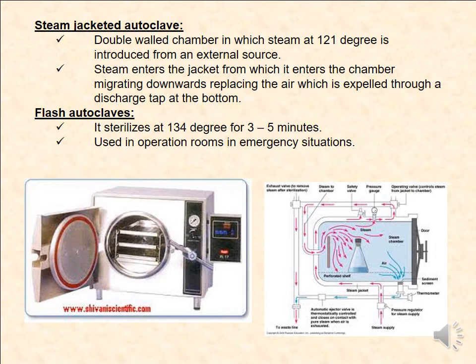Steam enters the jacket, from which it enters the chamber, migrating downwards and replacing the air, which is expelled through a discharge tap at the bottom. Flash autoclave sterilizes at 134 degrees for 3 to 5 minutes. It is used in the operation room in emergency situations.